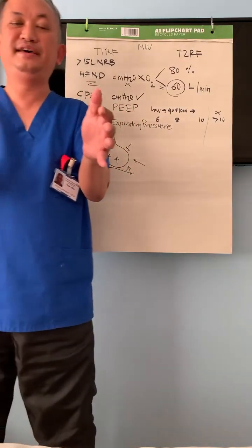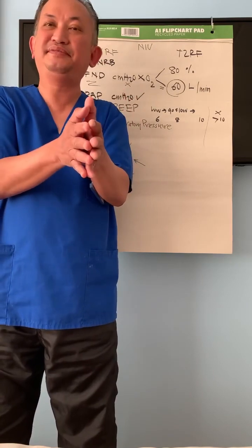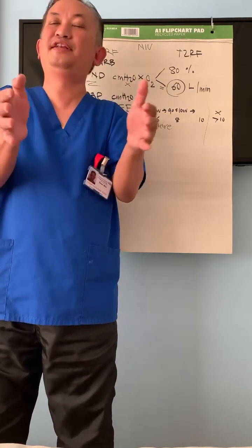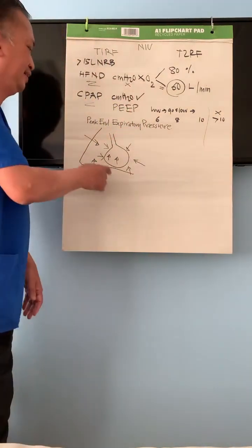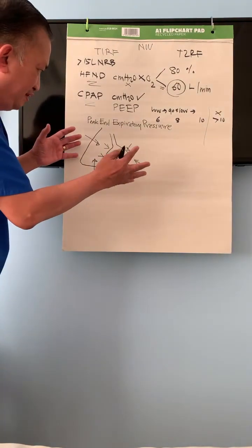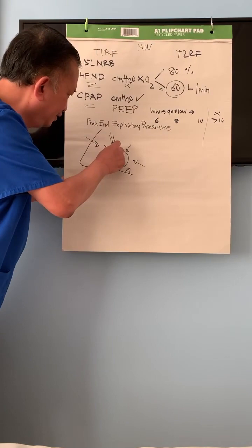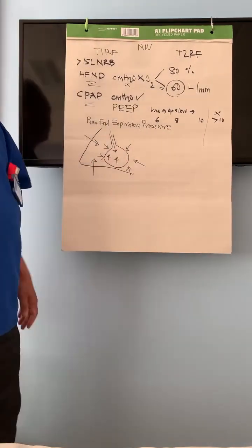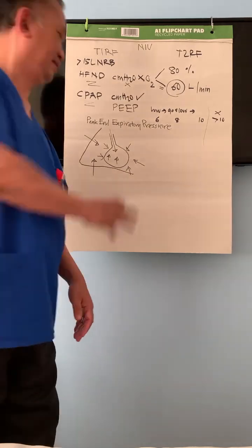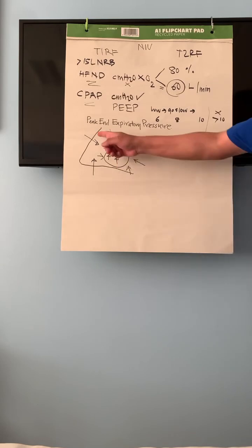So the aim of the treatment is to prevent the total collapse, and at the same time to make ready for opening slowly. That's why with CPAP, near the end of breathing out, CPAP is blowing a little bit of pressure to prevent the total collapse of the alveolus and small airway. That's why the name comes from it.